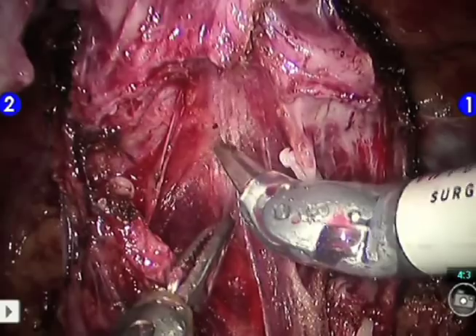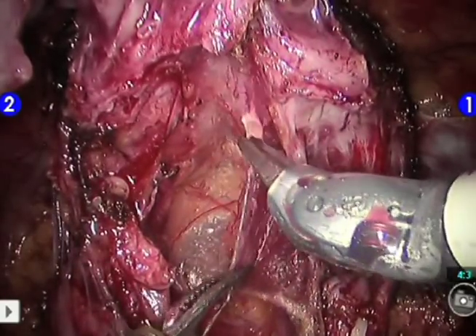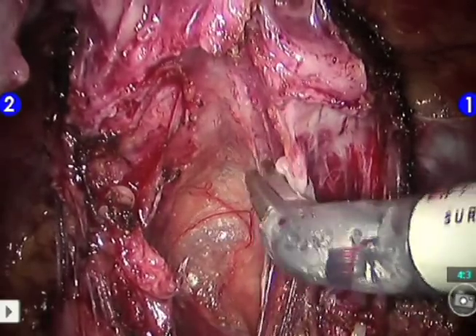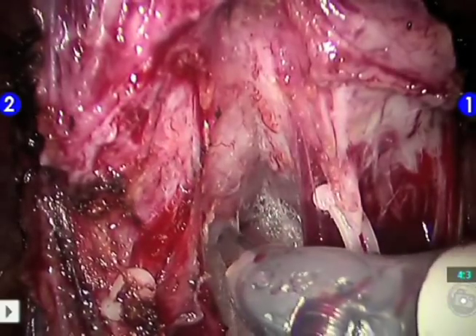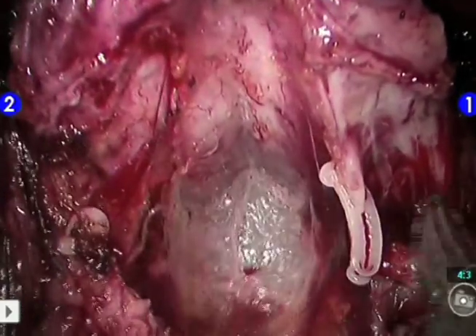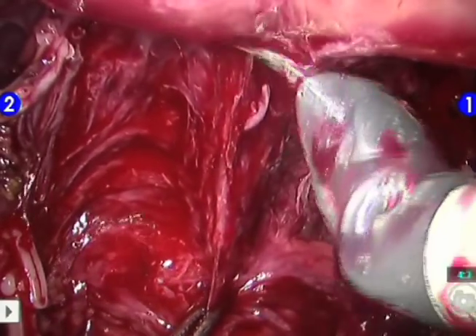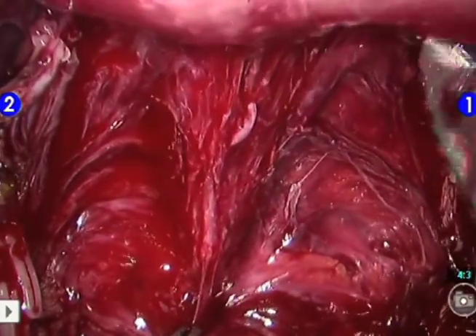This fascia is incised in the midline, and the opening is enlarged laterally toward the medial edge of the pedicles. The undersurface of the prostate is identified, and a plane is developed within the layer of Denonvilliers' fascia. A cave-like space is created behind the prostate, and the dissection is deliberately extended distally to release the apex and the urethra from deeper tissue.